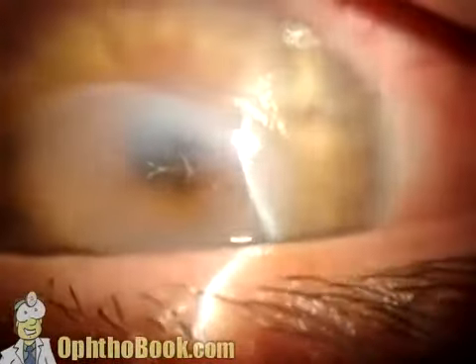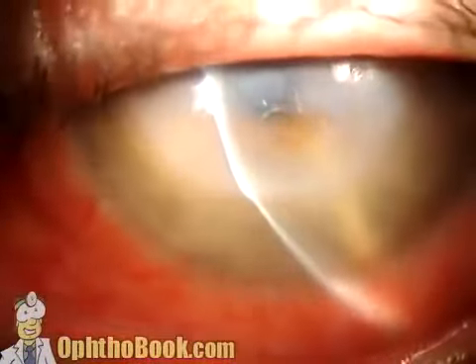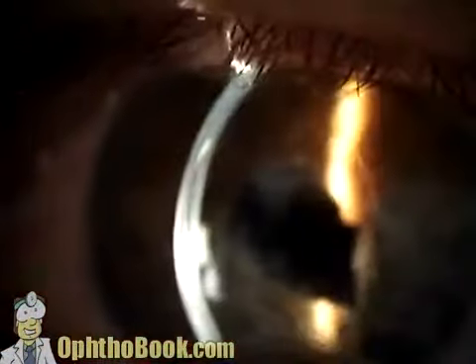This is a Dellen, an area of localized dryness that has caused thinning of the cornea right in this one little spot. Hydrate this and it thickens back out again. This, of course, is a corneal ulcer, and it's thinning right in the middle. And we know it's thinning because look how clear it looks right in the middle of this lesion. And when we move our slit beam across it, just look at how thin it gets at that one spot. It ended up perforating a few days later.